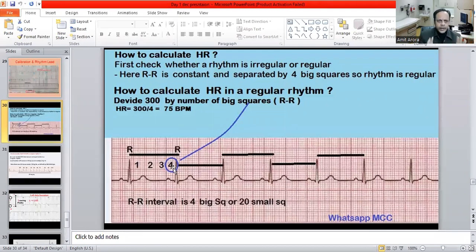Now we simply have to divide 300 by it. Just remember this. Don't worry about it. So 300. Now you might be thinking about where this 300 appears from. I would like to tell you it comes from physics derivations, as we learned in physics.